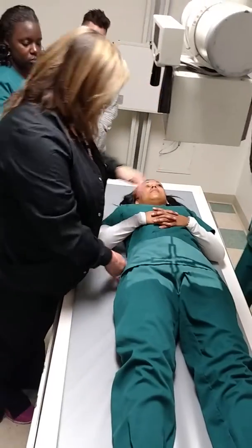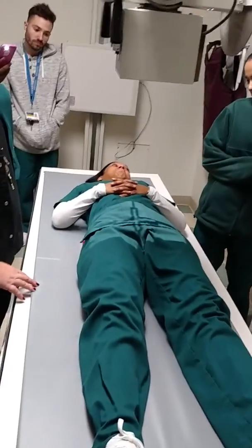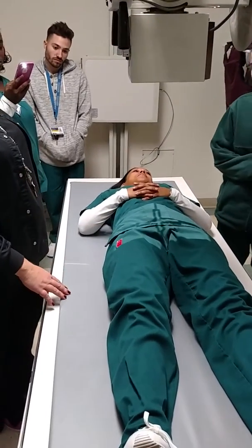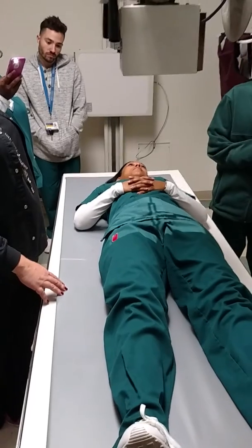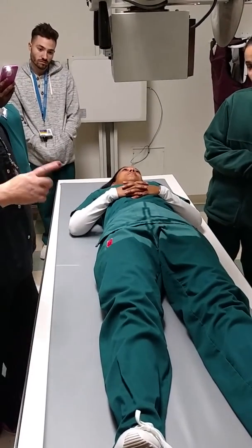So the last 2 patients I've had have been skinny minis, so that'll fit there, right? My right marker? That's not normally going to happen. You have to put it on top of it. So you're going to put it there on the patient. Does it matter if you put it on the bottom or on the top? Okay, so no and yes.